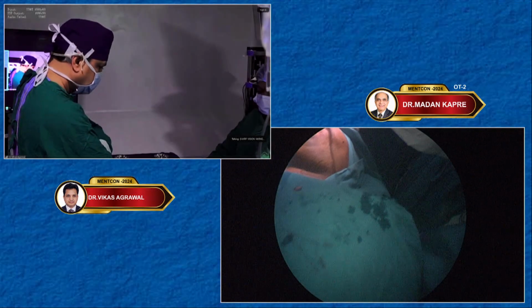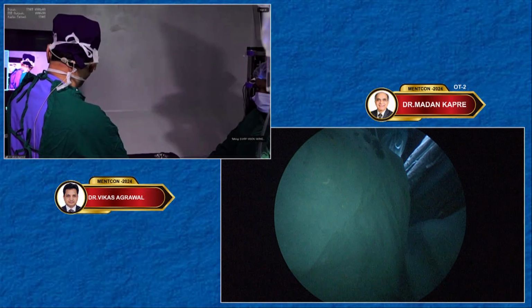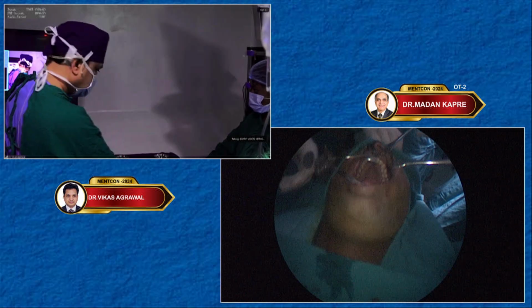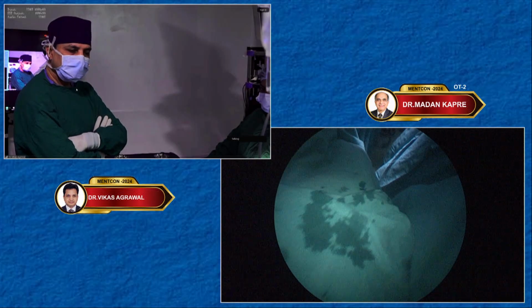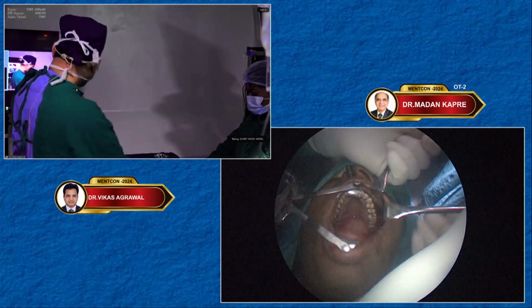Eventually, with all the pain and the physiotherapy, we still will get some loss and maybe settle somewhere between 3 fingers to 4 fingers. Now the next bit is Dr. Sudhanshu Kothe will take over, and before he scrubs, I will just get the last molars out. Dr. Sanjog will do that, but I want to show you how we trim the coronoid apex.